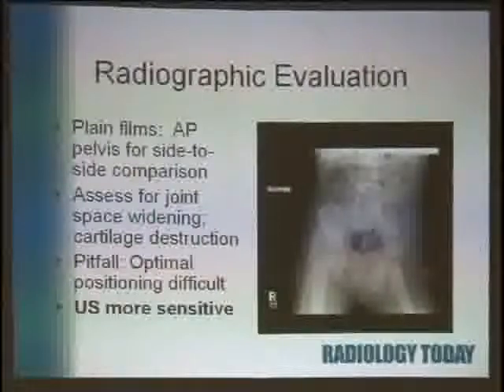When the child comes in saying, or may not be able to articulate, that their hip is hurting, we can always start with a plain film. I like plain films because they're quick, cheap, and easy to do in a lot of settings, hospital or outpatient clinic, and they give you a good overview. Is there a fracture? Is there some horrible mass lesion? It lets you look at the bones.